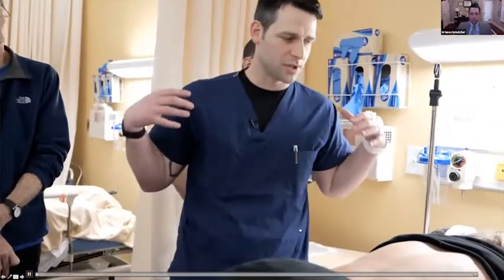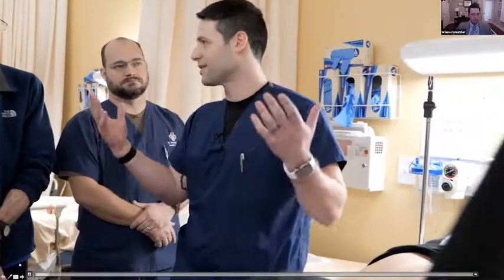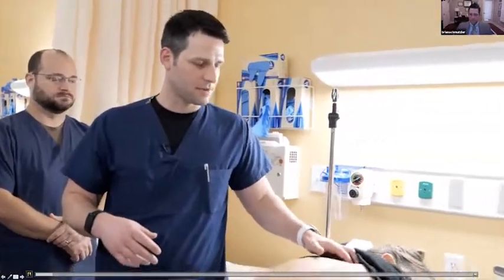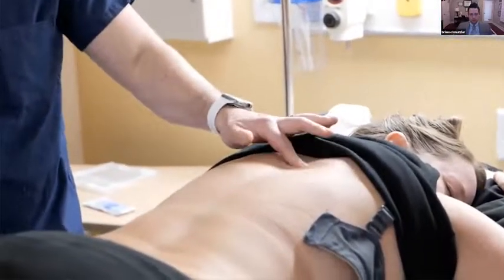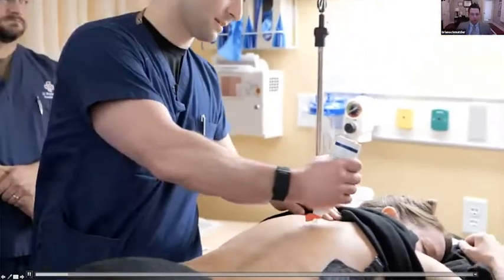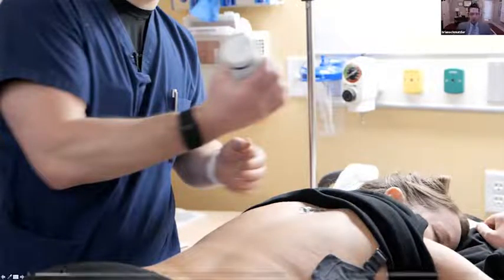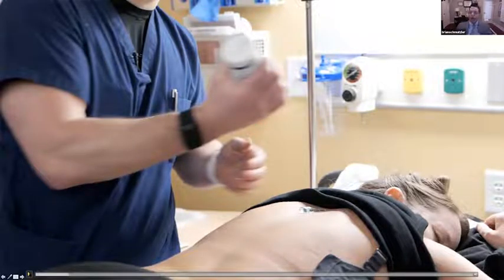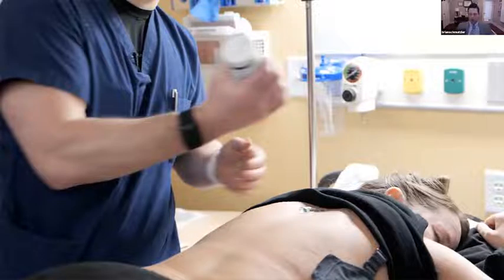I can't really use the scapula as a landmark, so I'll go up into the neck and call that C7 by convention. You get so much spread with this block that being off by one level — T1 versus C7 — is not a huge deal. I come down and count the levels: T1, T2, T3, T4 — that's where I'll start. We do these in the prone position, which really helps with positioning and probe placement. I typically go caudal to cranial; all our rooms are set up so that I walk in on the patient's left side, and I'm right-handed, so that just makes it easier.